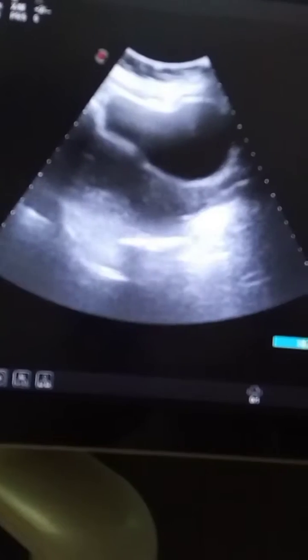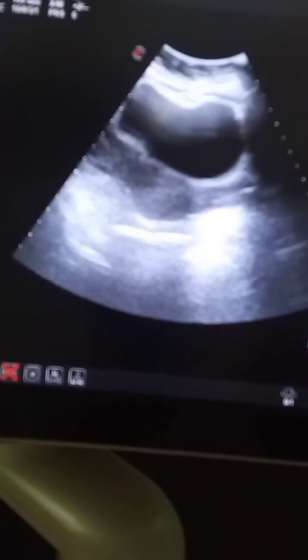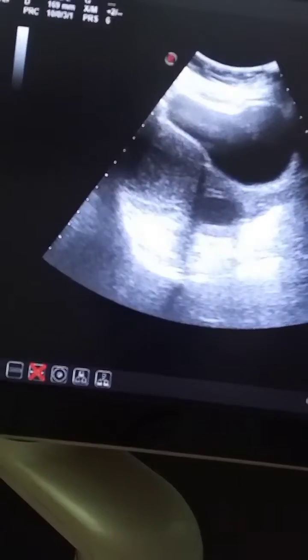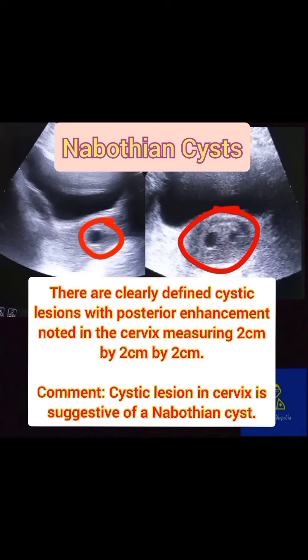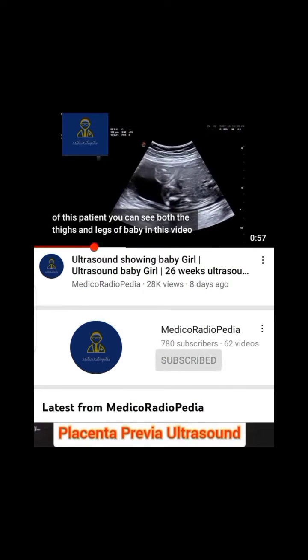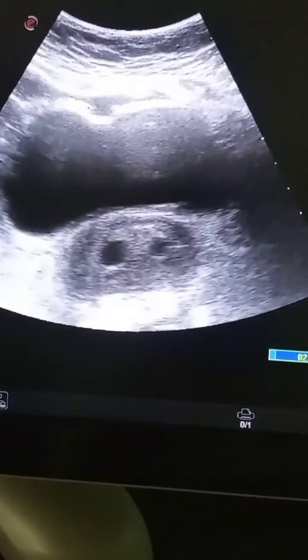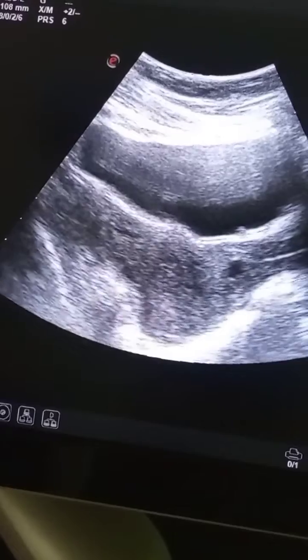You can see the uterus is opened very well. Now you can see the uterus again in long axis, and I am opening the uterus. You can see an anechoic area present in the cervical area — that black area with posterior wall enhancement. This is a Nabothian cyst.